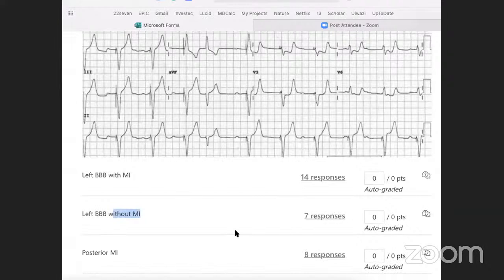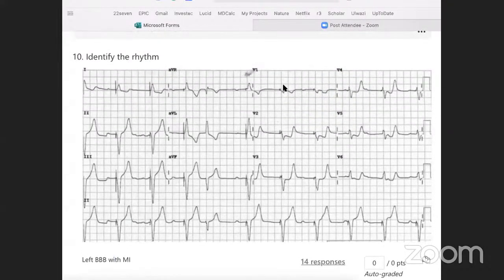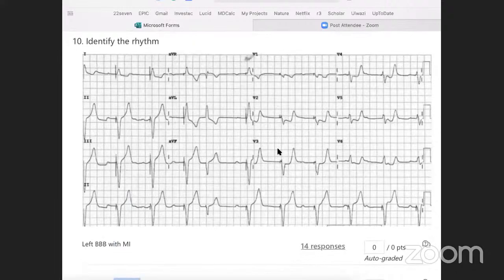And we know that for diagnostic criteria for myocardial infarction in the presence of a left bundle branch block, we used to say that a new or presumably new left bundle branch block is indicative of a myocardial infarction. However, that's an outdated way of thinking. And so there's the modified Sgarbossa or Smith's criteria that we apply to the bundle branch block to determine whether there's an MI in the presence of a bundle branch block. And so there are different criteria to please look up just in your own time.